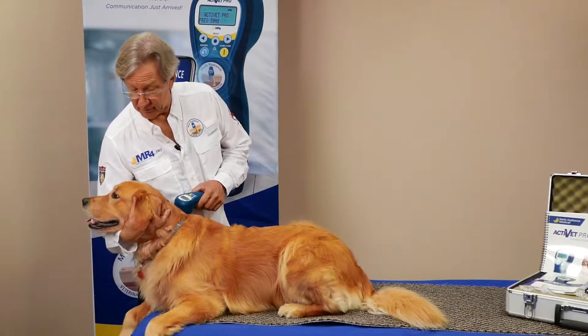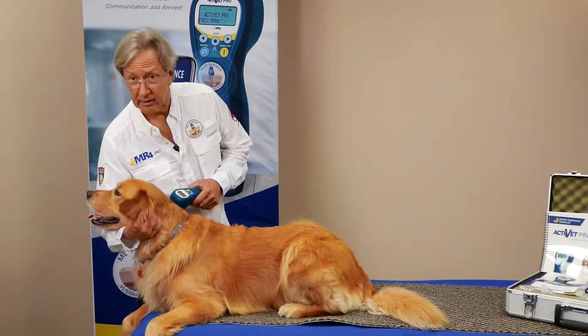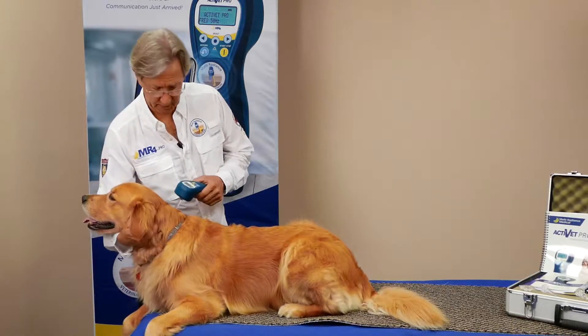Hi, Mark Strong back. We have Tango with us again today and we're working on different protocols to show you exactly how these are done.